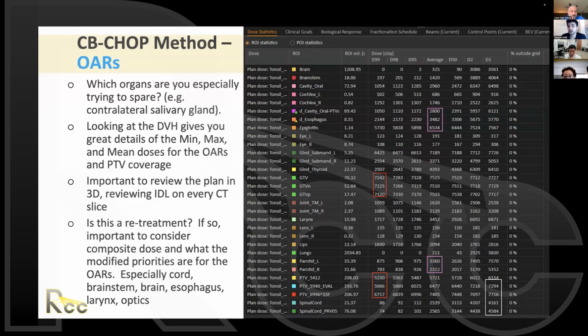And so OARs in head and neck are such a long topic, and we can talk about this for so long, but it's always driven by this understanding between the patient and the physician about what exactly is the treatment aim we're both going for, and what we are expecting to protect and what we are expecting to sacrifice, because the doses are very high. So when you evaluate the OARs, it's done with that in mind. And sometimes, not being able to meet the constraint is what you want. So it gets complicated.